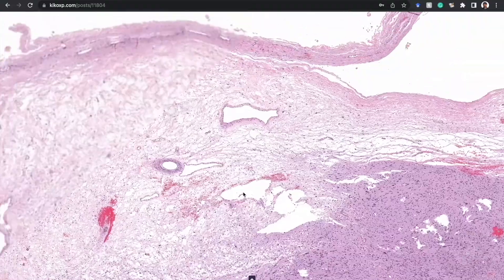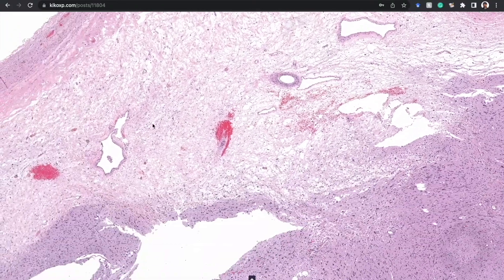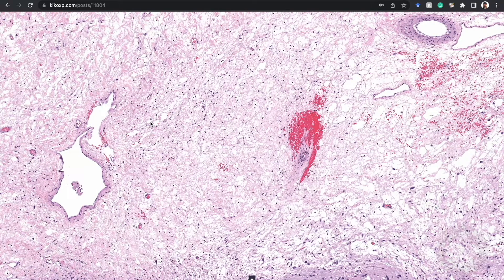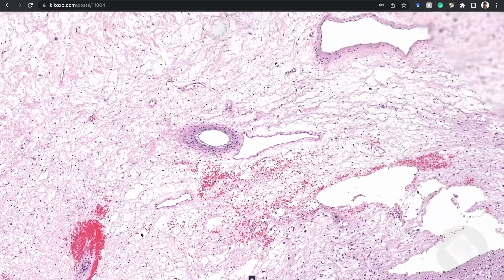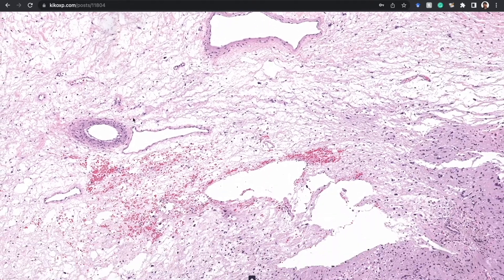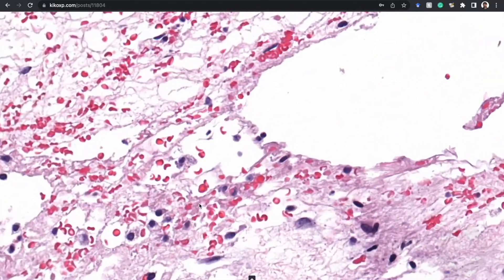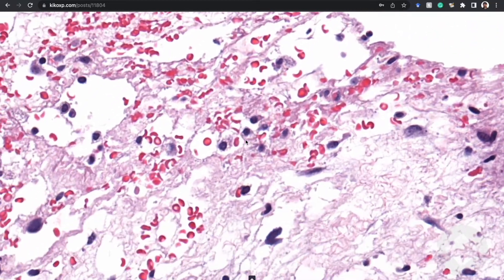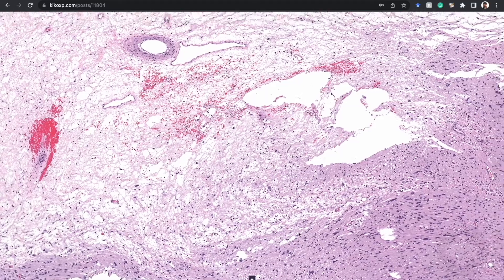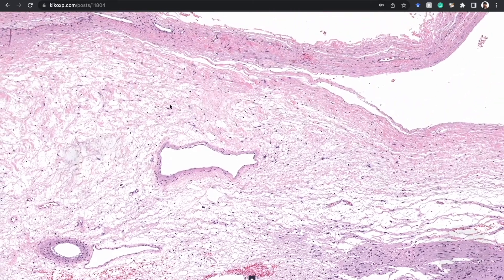Antoni A is the hypercellular zone; Antoni B is the loose areas that look myxoid or edematous — almost like a neurofibroma sometimes. You often have dilated vessels in schwannoma, usually with perivascular hyalinization. This one doesn't have much hyalinization or fibrin around the vessels, but you do see leaking blood, extravasated erythrocytes, hemorrhage, and hemosiderin — very common in schwannoma and really useful to be aware of.